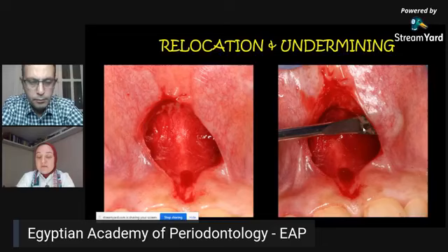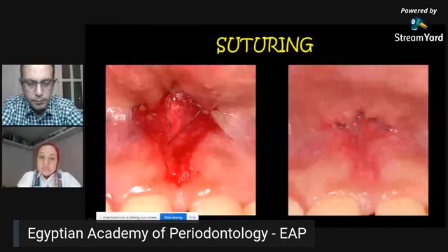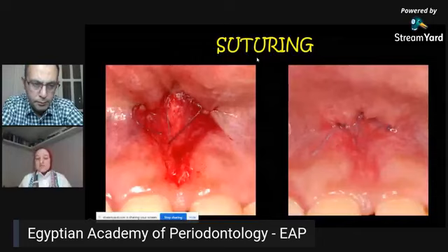And then we go for three periosteal sutures. The suture, the epithelium in the periosteum, here in the midline, and then the epithelium in the periosteum on the right side, and the epithelium in the periosteum on the left side, and you leave this to heal with secondary intention. I know this may look terrifying for some people. They may say, how can you leave such a bare area? But remember that we started with a partial thickness procedure. We don't have exposed bone, so it's not a problem at all. It's even more simple and less painful than an extraction socket.